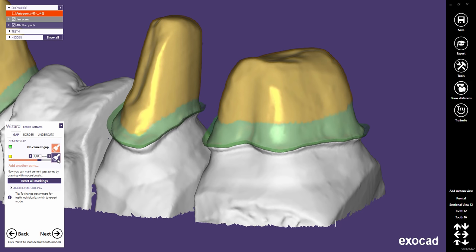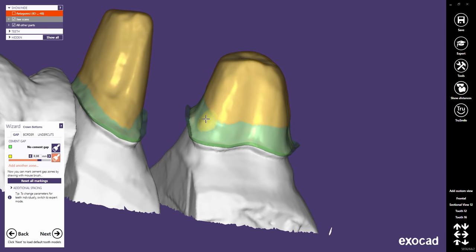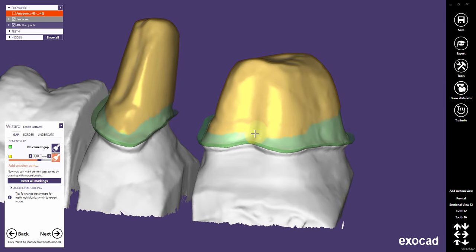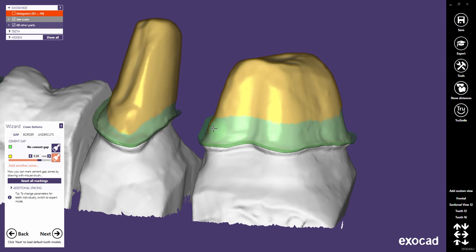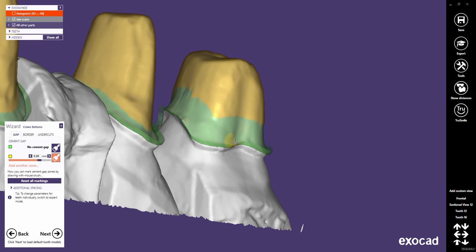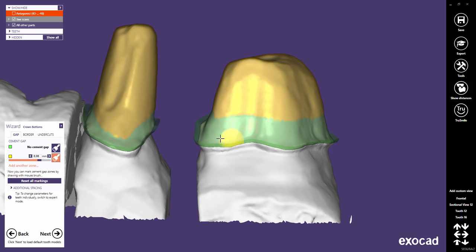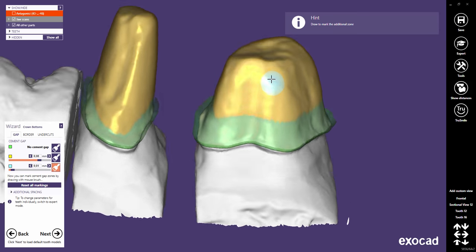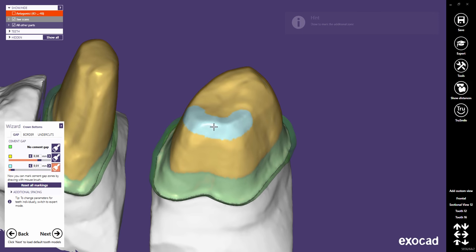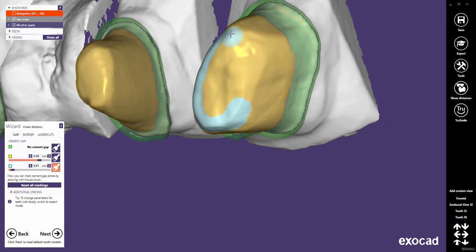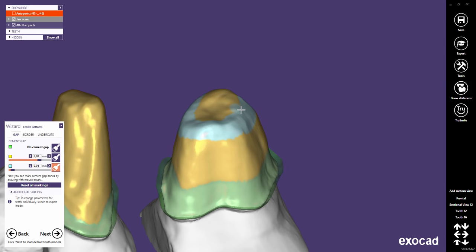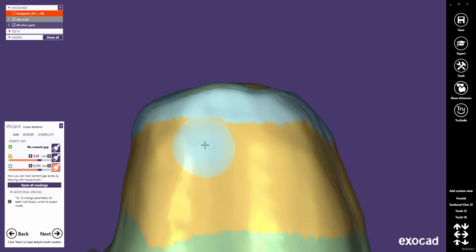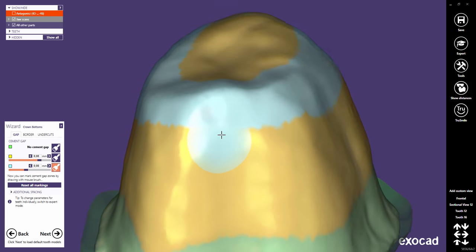Use Shift to inverse the brush interactively — this allows you to delete brushed parts very easily. Click on the Brush button of the other zone to brush and adjust the yellow area. Use Shift again to inverse the brush interactively. It is also possible to add an additional zone and choose an individual cement gap for this separate area.